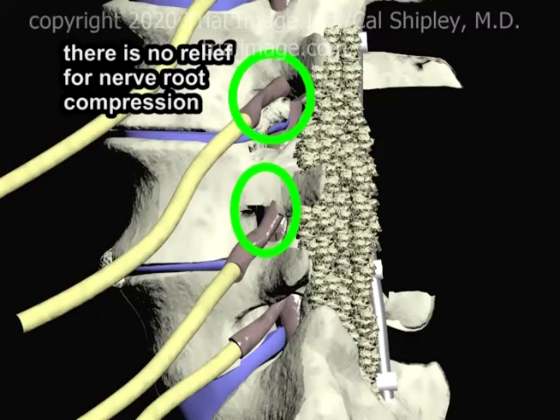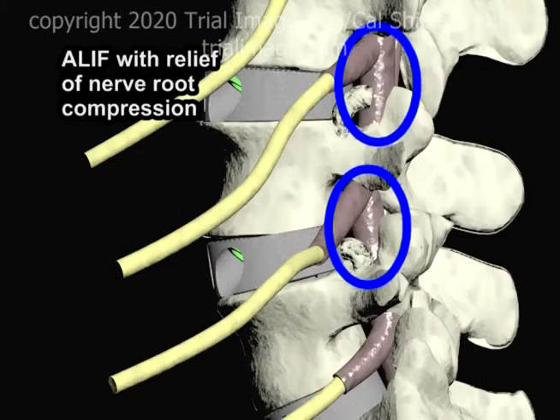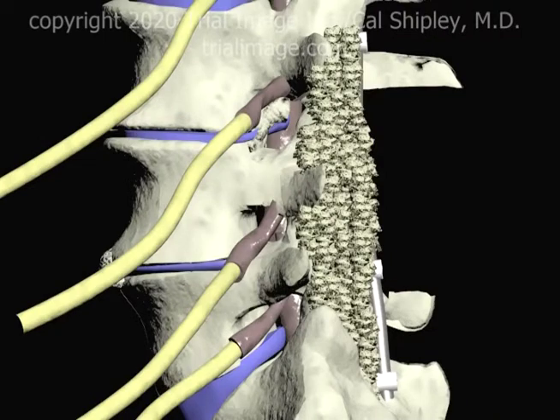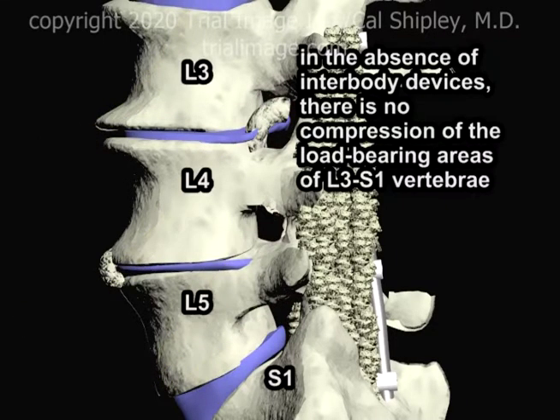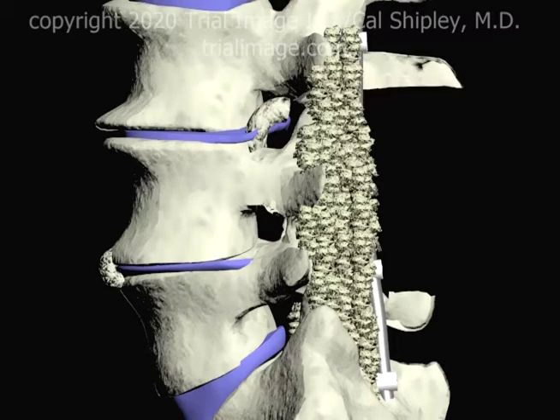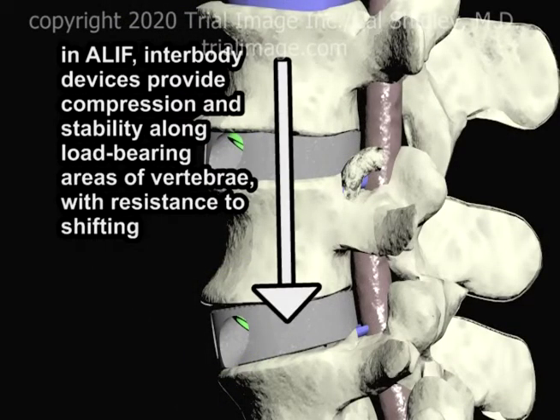There is no relief for neural foramen narrowing with the intertransverse fusion. Contrast that with the ALIF procedure, where the placement of interbody devices restores the spinal architecture and opens up neural foramina narrowed by previous disc collapse. In the absence of interbody devices, there is no compression of the load-bearing areas of the L3 through S1 vertebrae. In the ALIF, interbody devices provide compression and stability along load-bearing areas of the vertebrae with resistance to shifting.